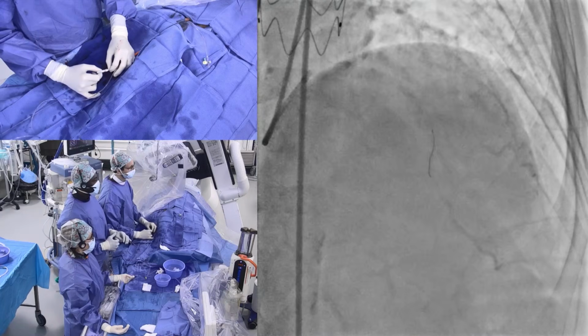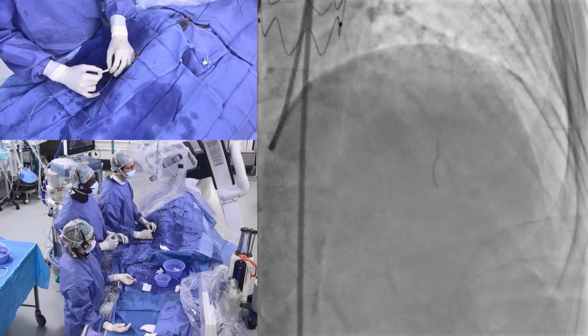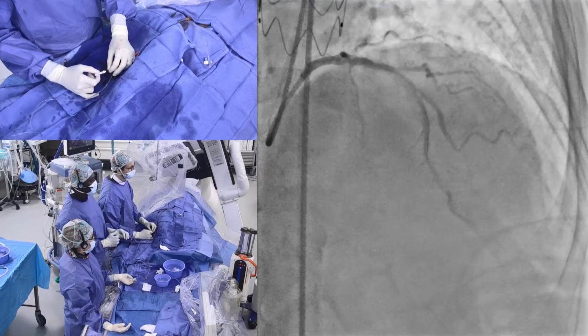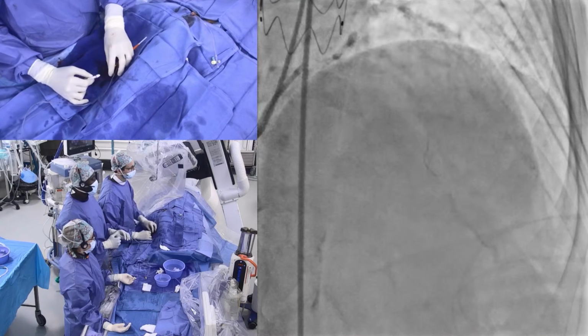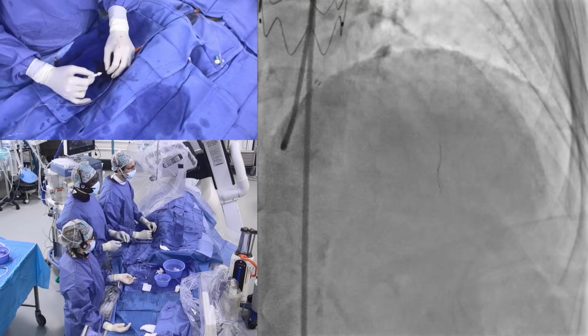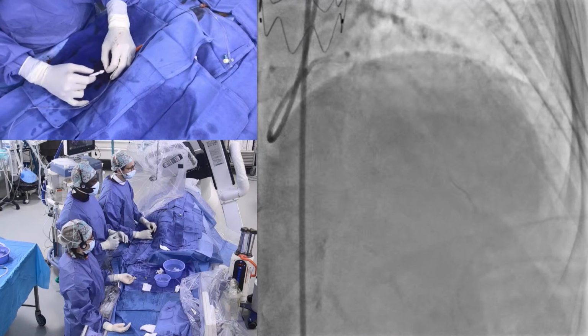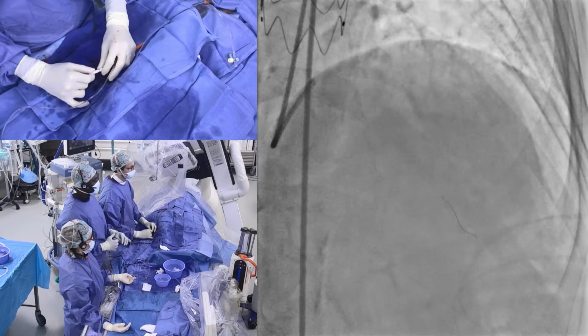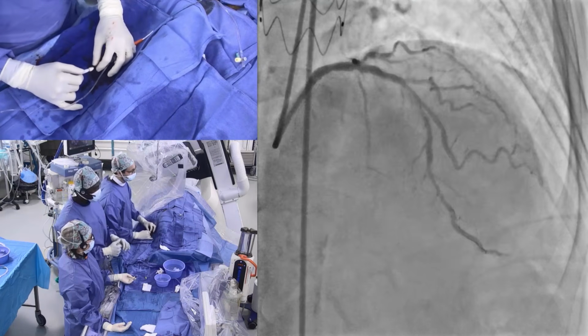That's something that certainly is going to help us and promote the use of a single wire, first to wire a very tight and eccentric calcified lesion, and second to deliver the rotational atherectomy. So Benjamin, you are the one using that wire. In terms of tactile feedback, how would you analyze that?